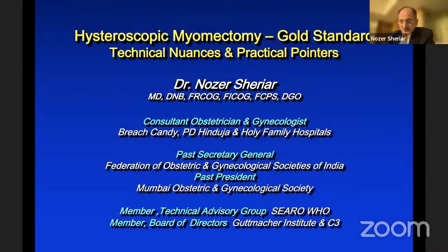You can't do adhesions, you can't do submucous myomas, you can't do a septum, you can't do most Mullerian anomalies without hysteroscopy. Doing it any other way would be unethical. Well, you can do a hysterectomy differently, and that wouldn't be unethical, and a lot of other things we do differently, but not hysteroscopic surgery.